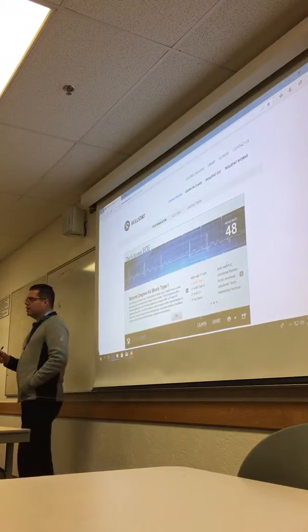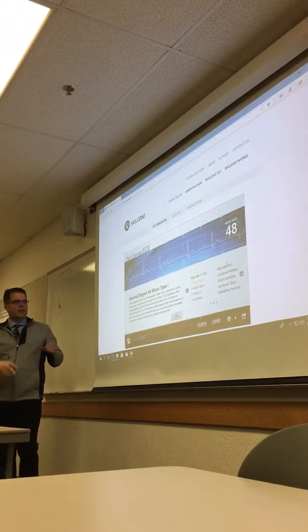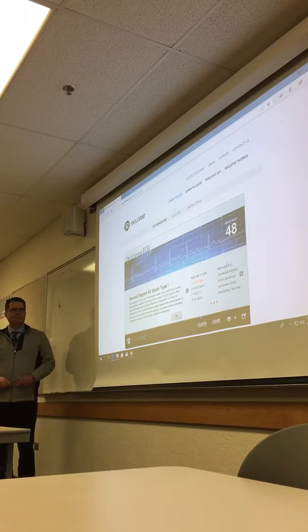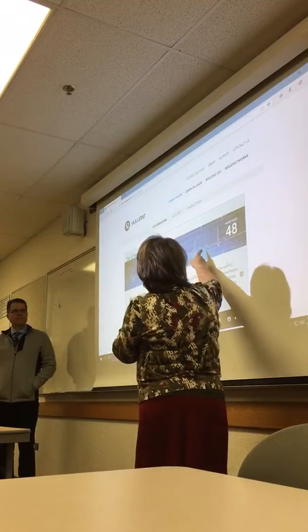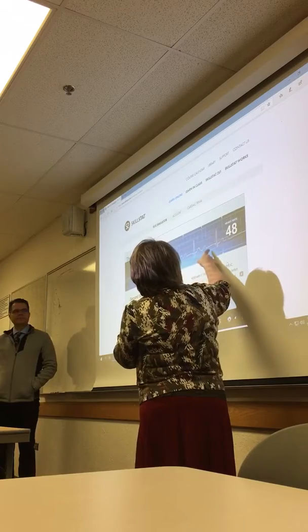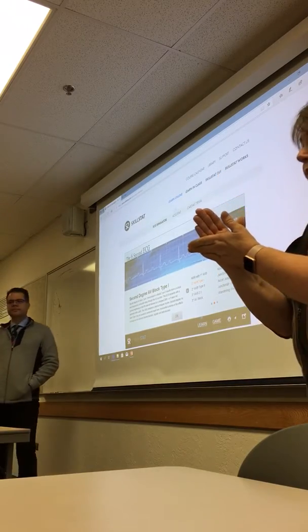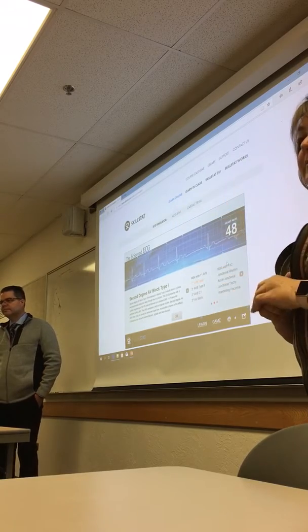So after that one, there's no QRS, where there's supposed to be one, it just drops after an elongated PR, they call it Wenckebach or Mobitz type 1. So when it drops, we still often have a P wave. Here's your P wave, but nothing. Longer drop, but we still have a P wave, no QRS. So there was a block after that P wave, and as it's getting cyclically longer and longer, there's a drop and it totally blocks and drops that QRS.